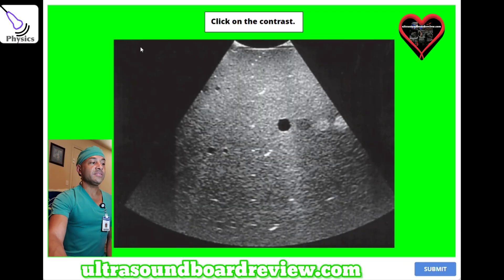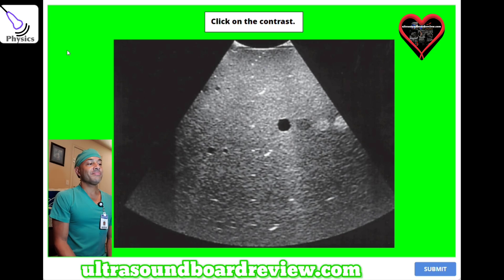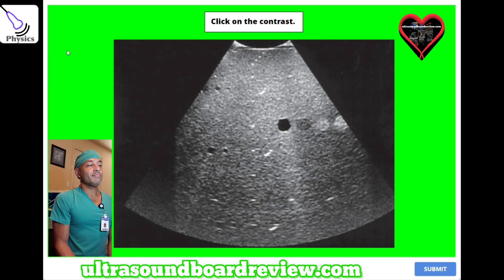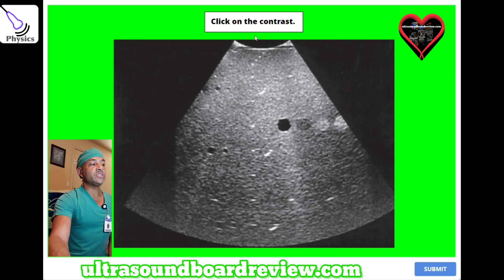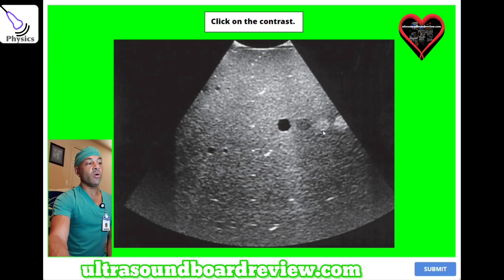Click on the contrast. This is an ultrasound phantom, and these little circles here will help optimize or evaluate contrast resolution. Any one of these will be good.